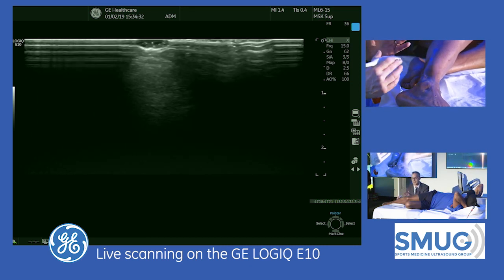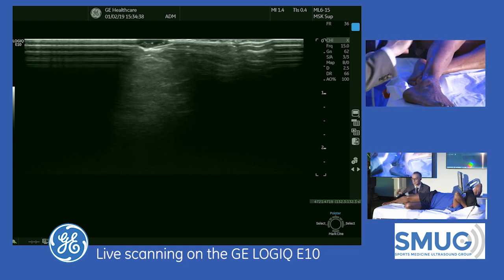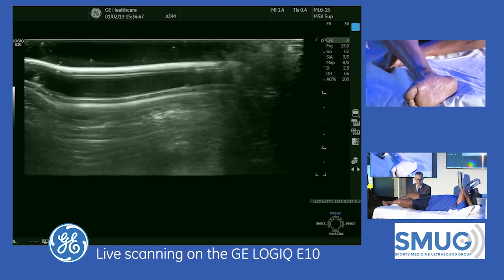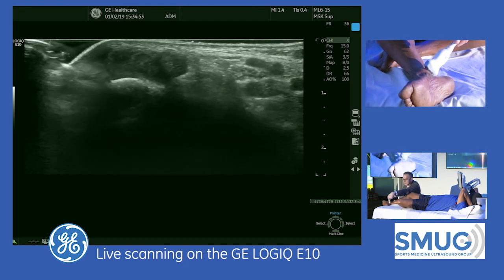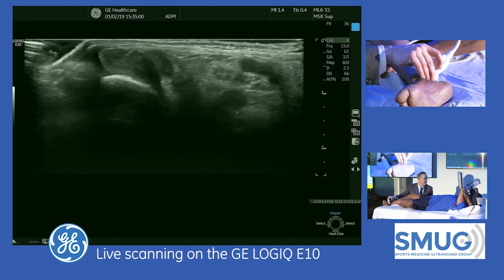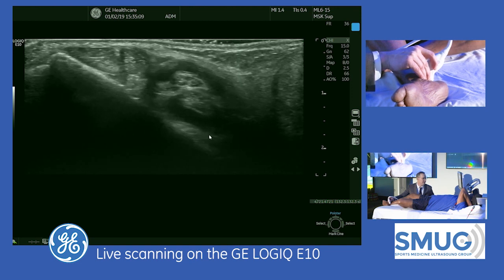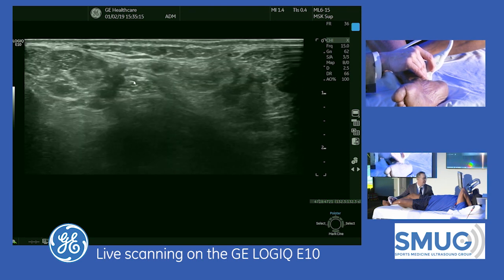For all these nerves, I have one point where I can find it, then you can trace them up and down. Let's go to the tibial nerve — we're going to look at the inside of the ankle. I'm going to look at the tarsal tunnel and put the transducer behind the medial malleolus. What we see here: tibialis posterior, flexor digitorum longus, two veins, tibial nerve, FHL muscle and tendon. So here we can see the tibial nerve.